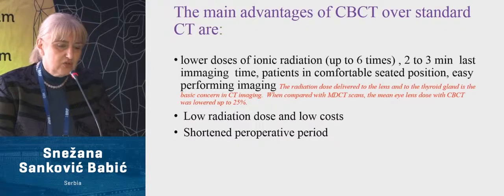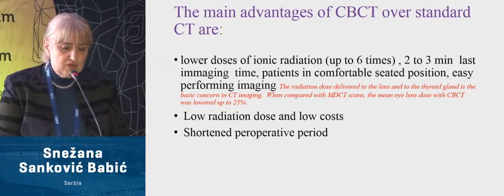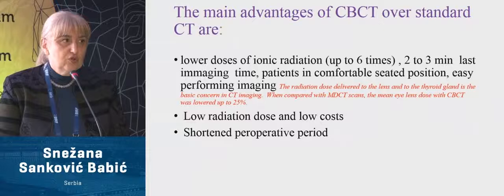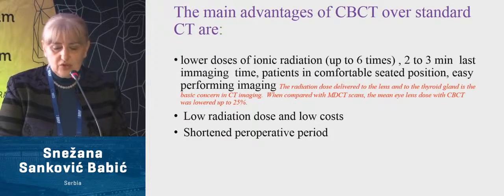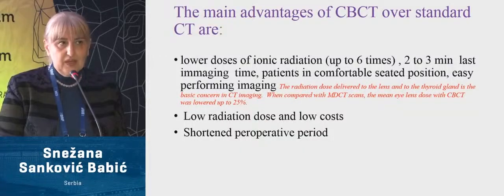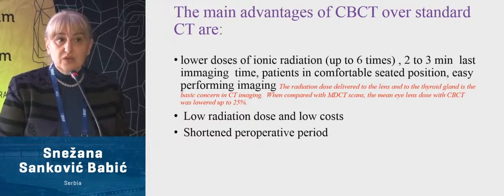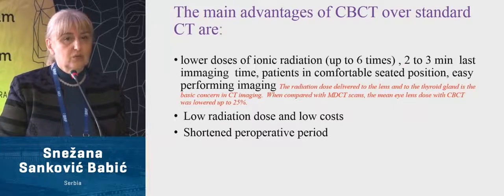So the main advantage of CBCT over standard CT is low doses of radiation and a short period of time for the imaging process. Low radiation doses and low costs. It means a shortened preoperative period. Our patient came to our morning clinic, we send him to make a CBCT, and during the same day, or maybe the day after tomorrow, he brings you the result, and you can start with the planning.